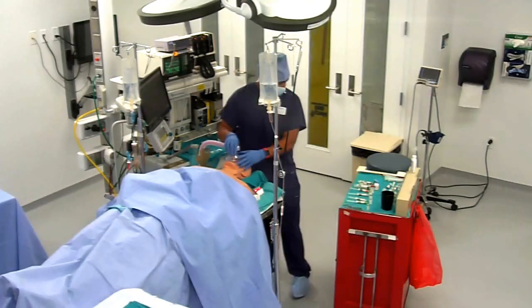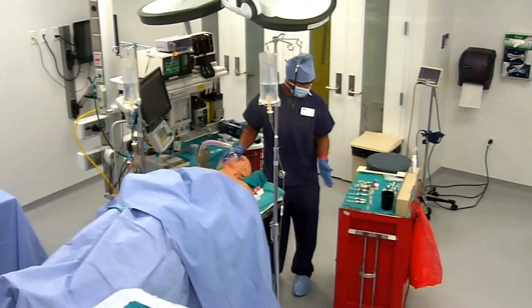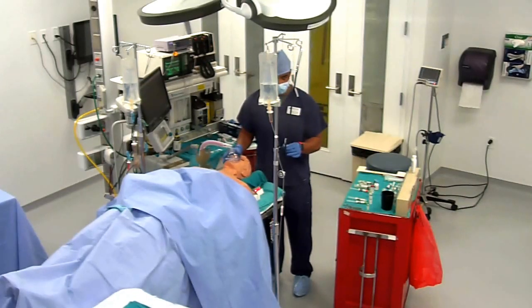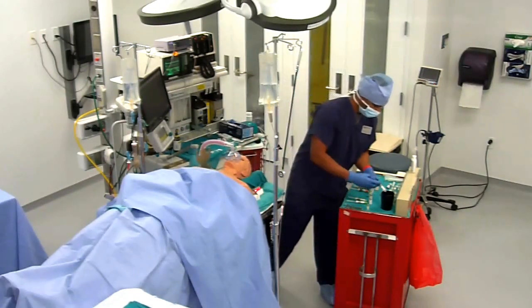Okay. So now I'm going to go with a neuromuscular blocker, succinylcholine or rocuronium. And you're doing a gallbladder that's gonna last, say, an hour. So an hour is the duration of rocuronium. So rocuronium, which is 0.6 to 1.2 milligrams per kilogram. But then Tracy told me that we never give more than 50 milligrams, 5 mils. So here's a 5 mil syringe. So you give her maybe 50 milligrams? Yes. But just say you're gonna give her, just give her 10 milligrams of that. 10 milligrams. Otherwise, they'll be paralyzed for a long time. So just give her 1 cc of that. You don't have to squirt it out. Sorry.